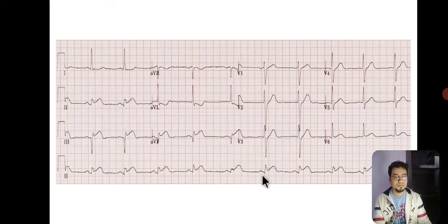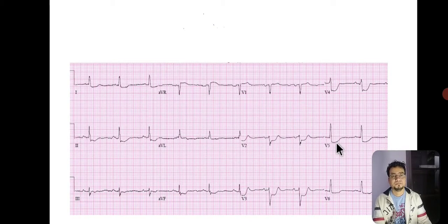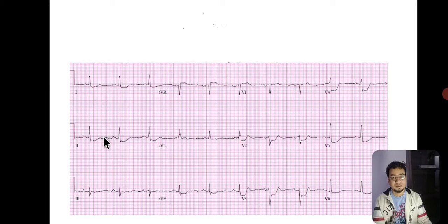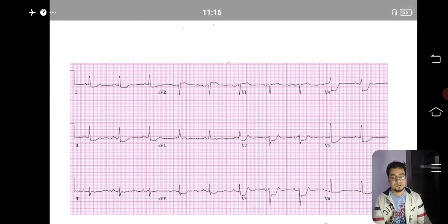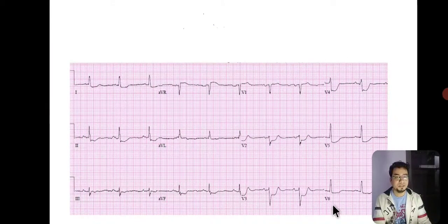Inferior wall MI usually presents with sinus bradycardia, bradyarrhythmia, or sometimes AV blocks, so you need to check the PR interval as well — in this case the PR interval is probably normal. Now look at this ECG: the ST segments are depressed in various leads, especially leads 1, 2, 3, and V2 through V6. Multiple global ST depression is a sign of myocardial ischemia and may be a harbinger of acute MI.